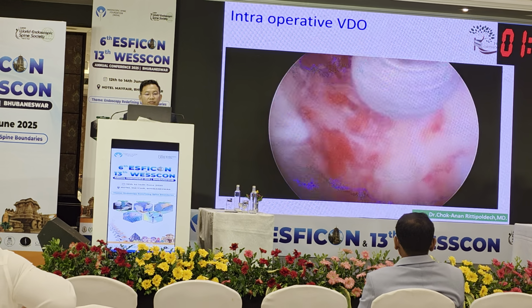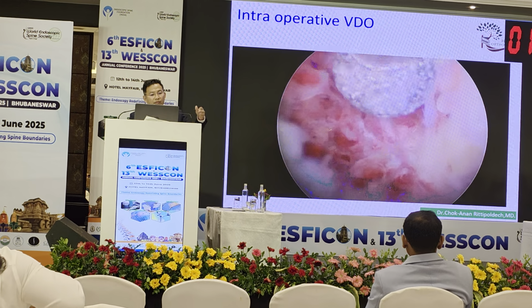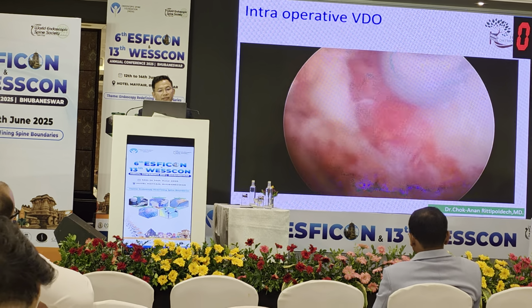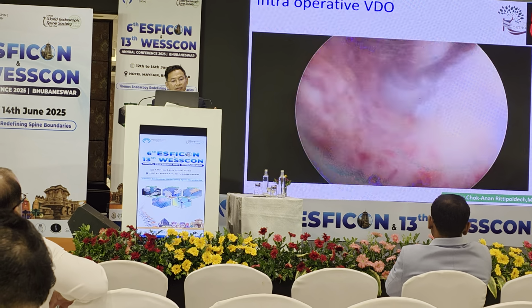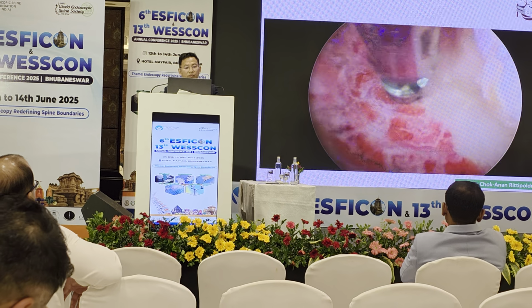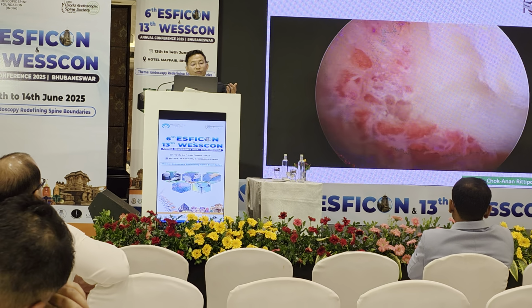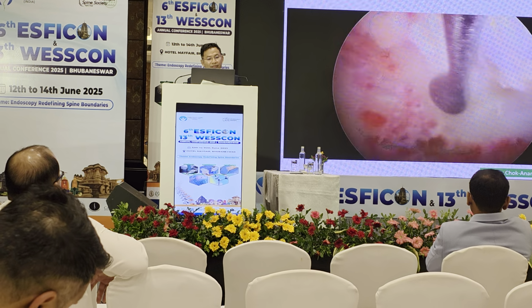For this case, I do the over-the-top technique from the other side, the contralateral side. You can use an oval burr for your field, like Dr. Monoportal.